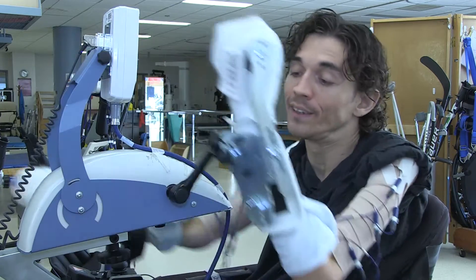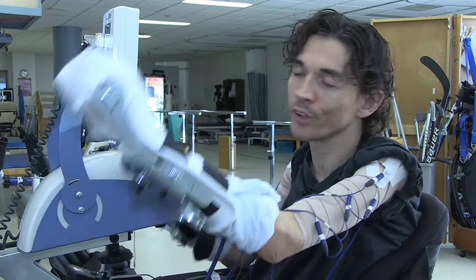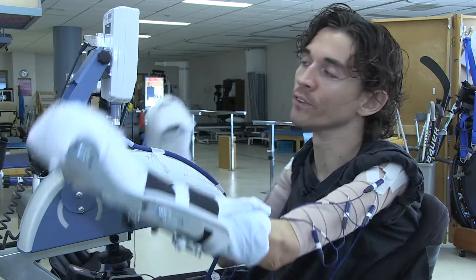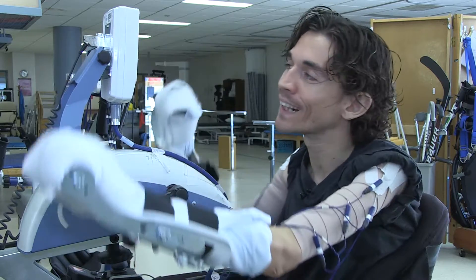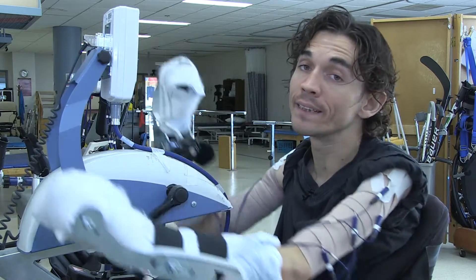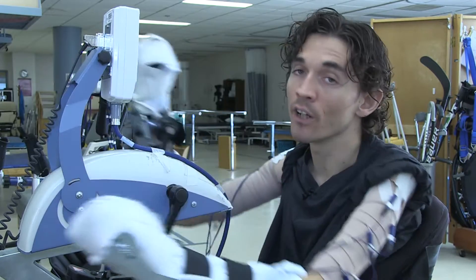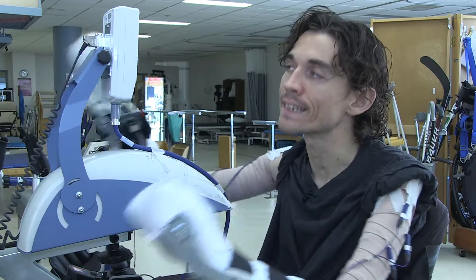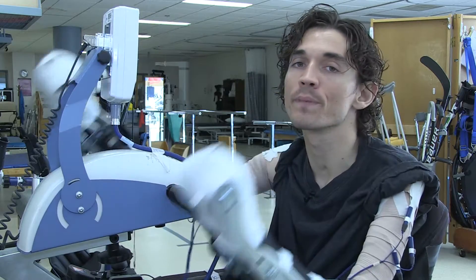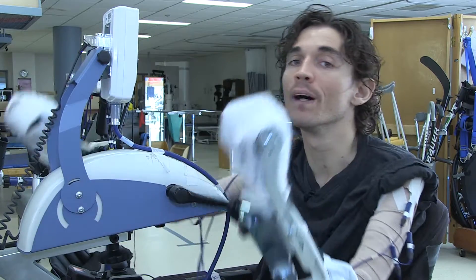My spinal cord injury is a cervical level injury, specifically at the C4 level — C4 ASIA B — which means it's also incomplete. So I'm able to move various muscles in my arms already, and the machine is assisting what I'm already capable of doing. I have function in both of my biceps, my deltoid on my right side, and my anterior deltoid on my left side.